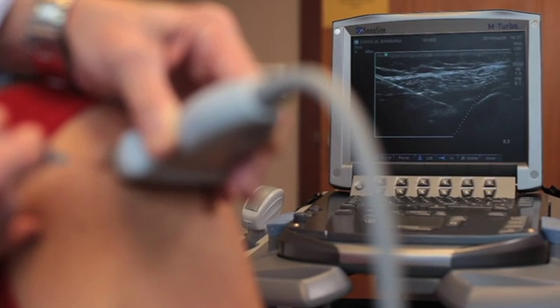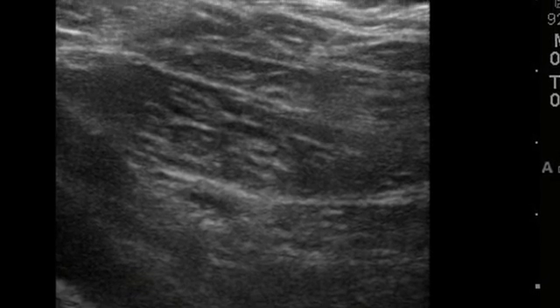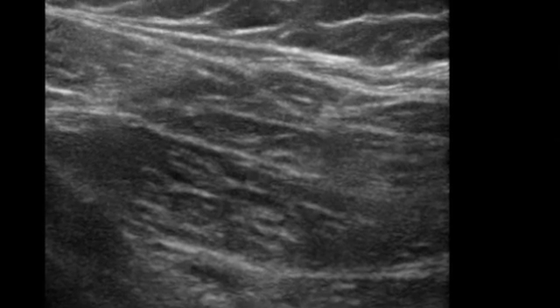I think for some people the main purpose for using ultrasound will be to help them do injections and aspirations into joints that they never could get to before. When I'm examining a large joint like the hip or the shoulder on someone who's muscular or obese, I have to have a steep angle and that can create a big problem seeing the needle. But when you flip on this new technology, you can see it.